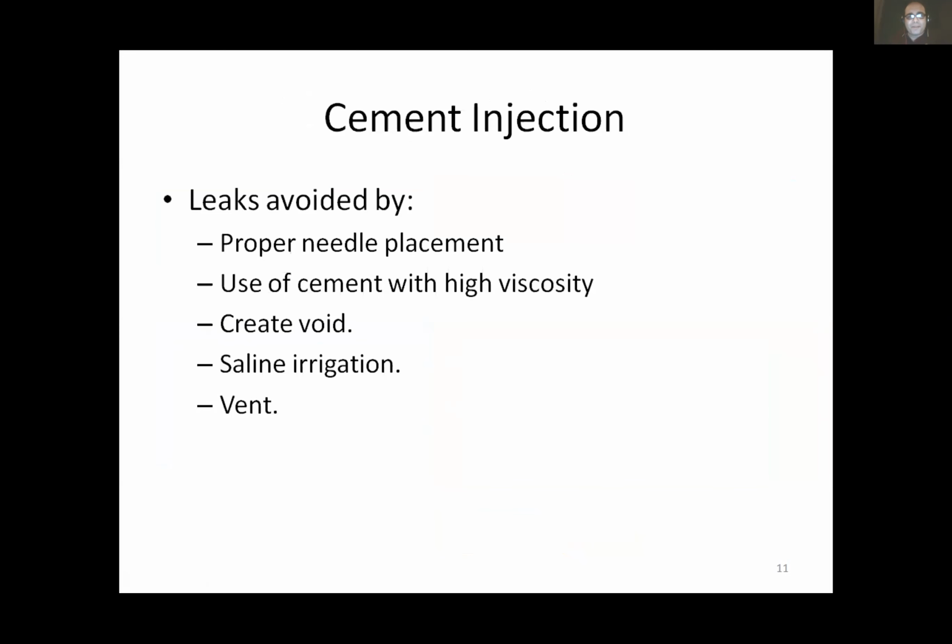After proper needle positioning and application, you need to use the cement. And in order to use the cement in the proper way, you need to have a void. A void can be created by kyphoplasty, as we heard from the previous presentation, but I am against kyphoplasty. It is very expensive, plus it destroys some bone trabeculae.